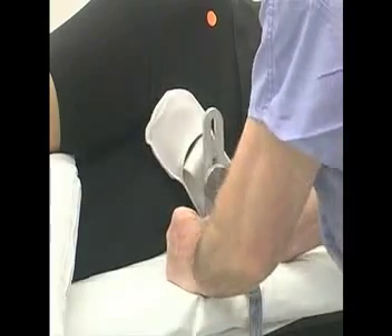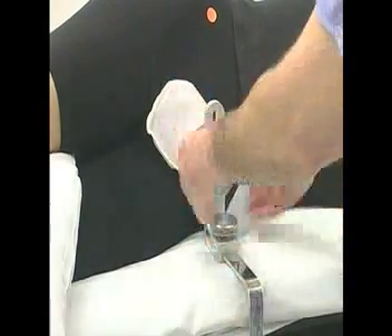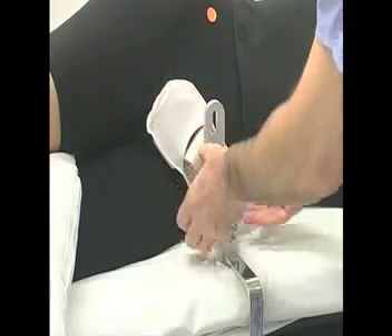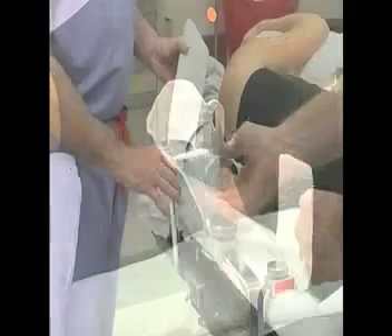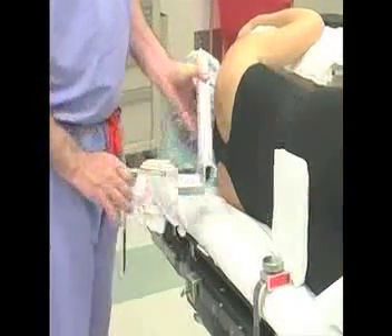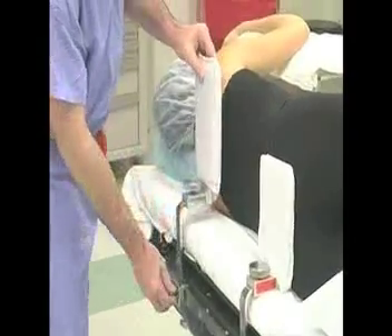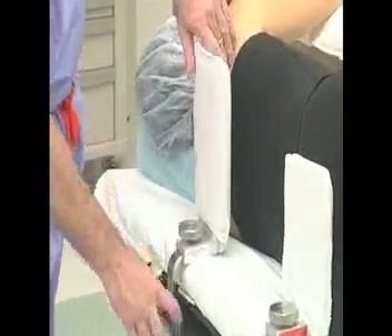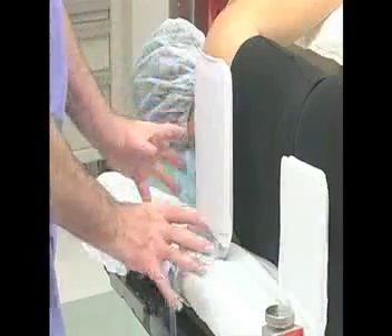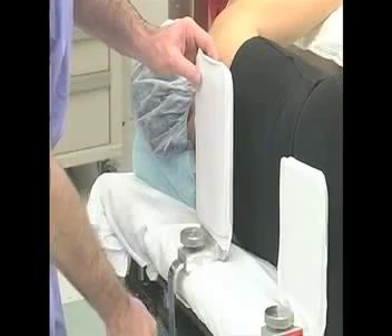In obese patients, have the assistant pull the panniculus up and out of the way of the downside anterior superior spine of the pelvis and the symphysis pubis. This will allow the pelvis to be supported over the bony prominences and not on the adipose tissue or other vital soft tissues. The abdominal skin in obese patients may touch the anterior pelvis upright metal — place a towel between the metal and the skin.